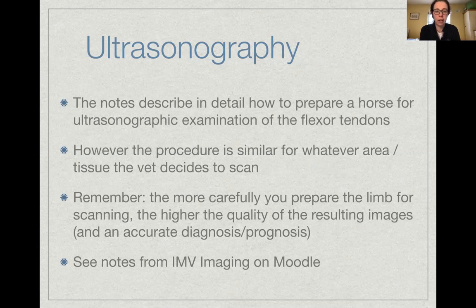Again, that's something the vet can ask you to do while they go off and talk to the owner or look at the radiographs. So they should come back and be ready to take good quality images from the beautifully prepared limb that you've left for them. Okay, so have a look through the notes. I've gone into detail on how to do the task.